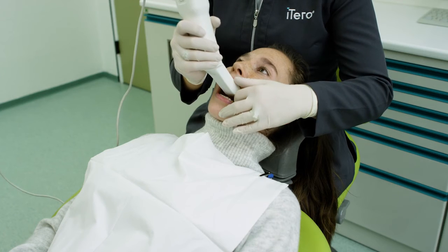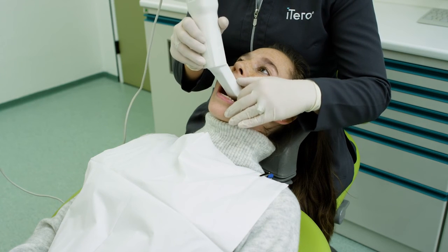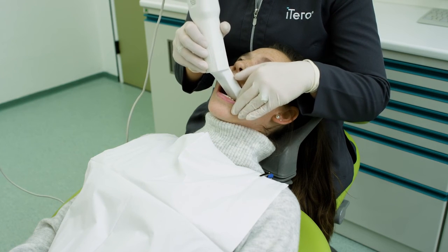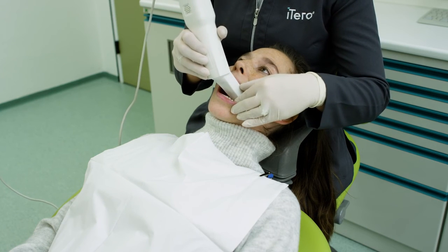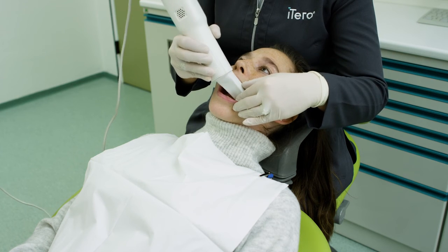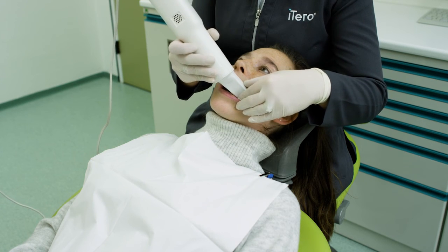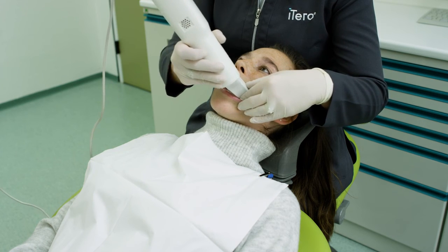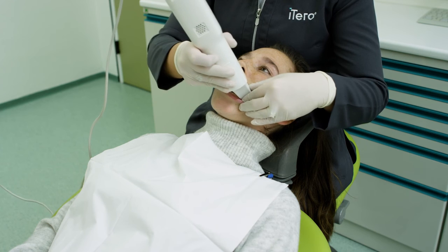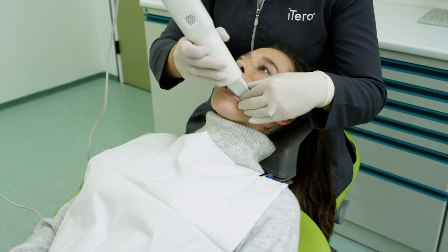To capture the distal of the terminal tooth, place the wand on the occlusal surface of the terminal molar. Have the patient partially closed and shift their lower jaw toward the side being scanned as you roll the wand to the buccal surface.